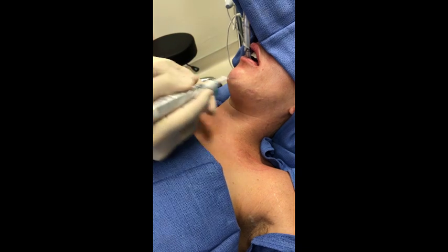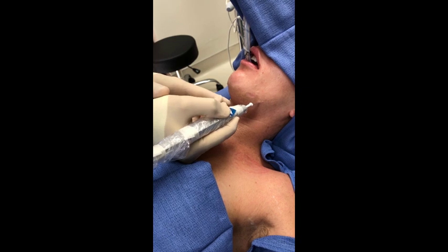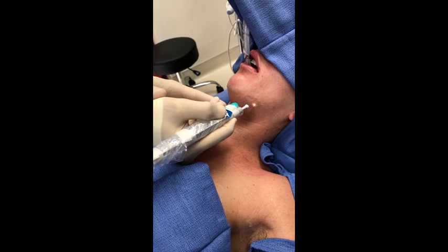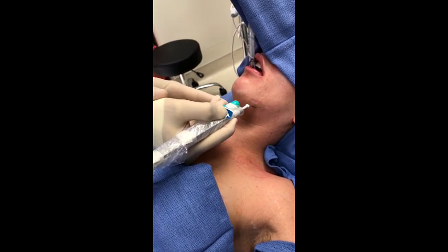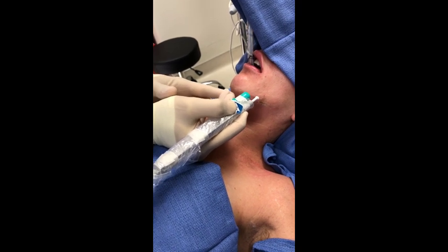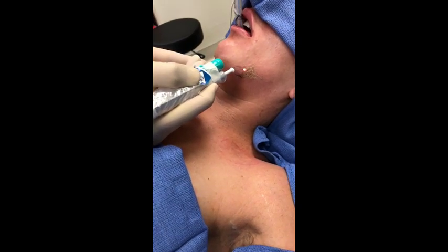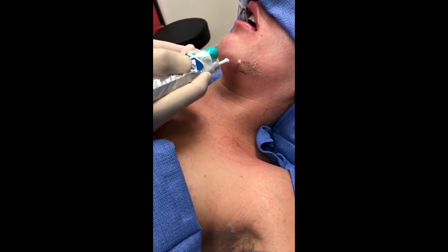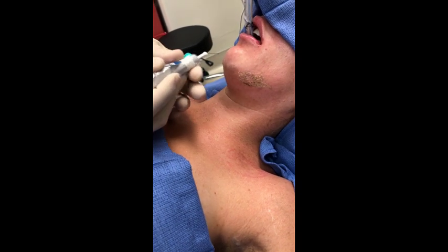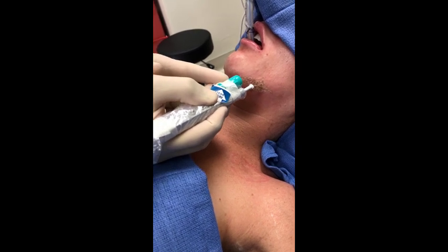What I do is I will take my electrodesiccation device and I will go across these areas and cauterize them at a very superficial level. By doing this, it's kind of like doing a CO2 laser. We are creating an external damage to the outer layer of the skin, the epidermis, and this is going to flake off with brand new skin underneath in about a week.